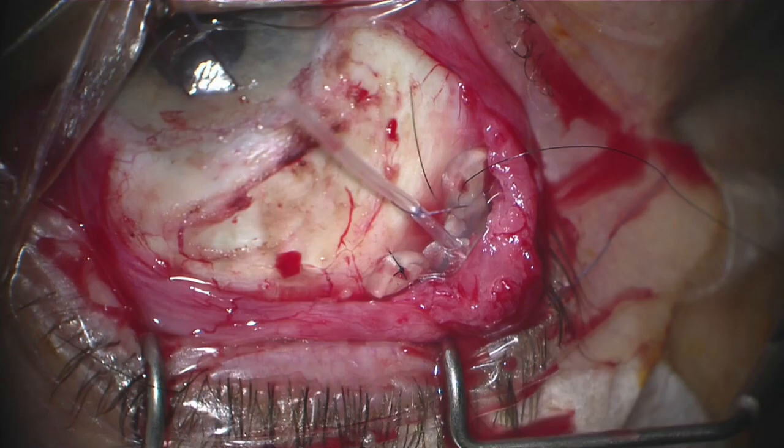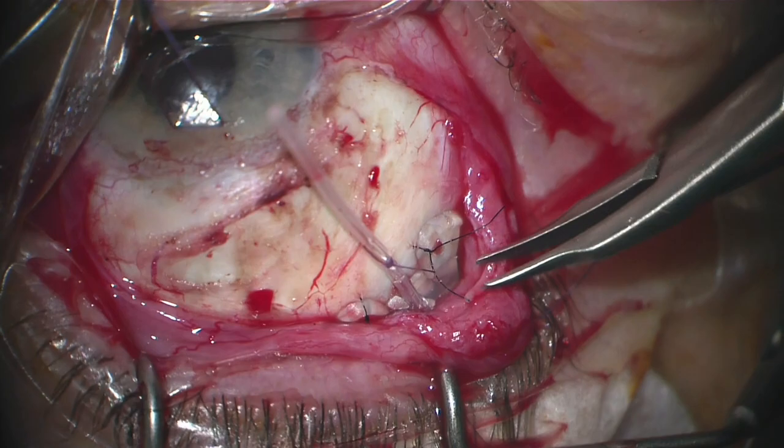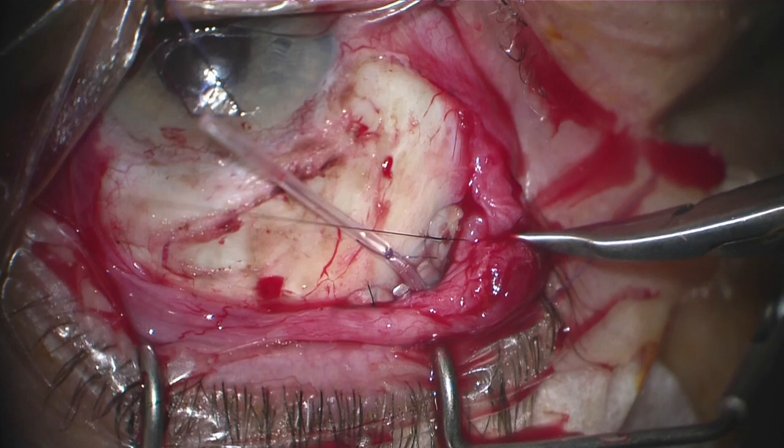We want to make sure that the implant is secured in place. We are passing two 8-0 nylon sutures. The knots of this non-absorbable suture need to be rotated into the eyelet so that we don't end up with erosion or extrusion of these knots down the road.